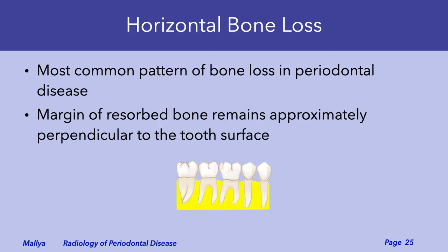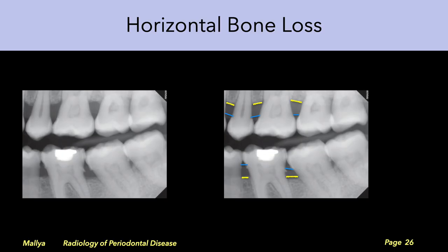The most common pattern of bone loss is horizontal bone loss, where the margin of resorbed bone remains perpendicular to the surface of the tooth. This radiograph demonstrates a horizontal bone loss pattern. Note that the level of bone, shown in yellow, continues to remain parallel to a line joining the CEJs of the adjacent teeth, shown in blue.